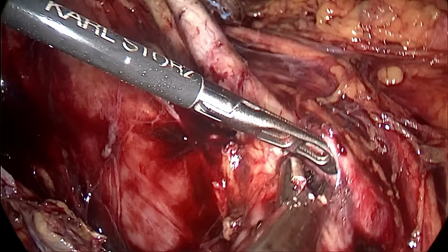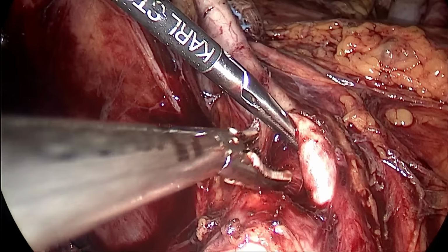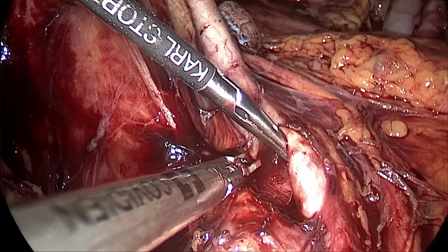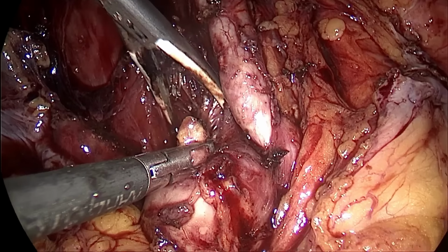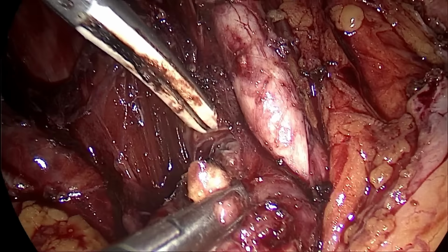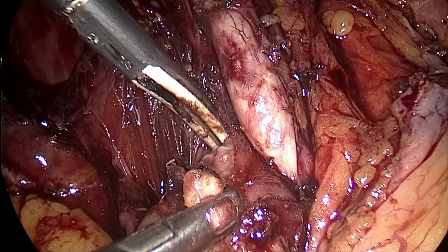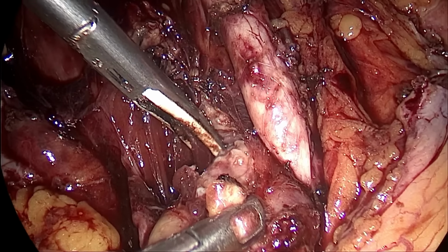That's our left common iliac artery. So I'm trying to skeletonize the lymph node from the vessel. I'm trying to make a plane in between them, the psoas and the node, and also the node and the vessel.